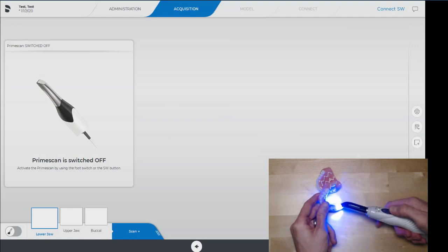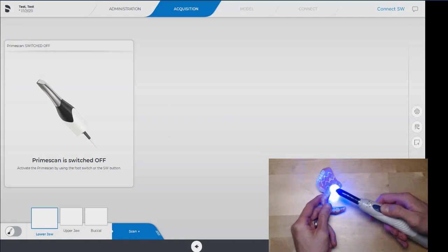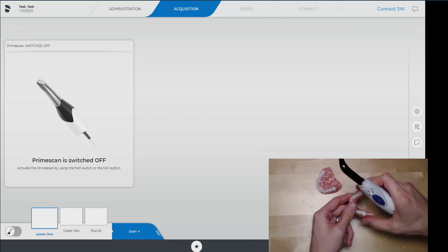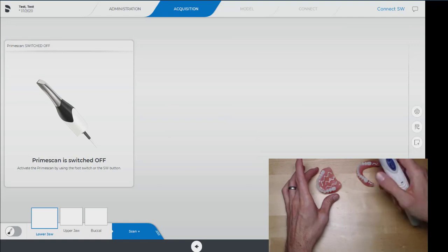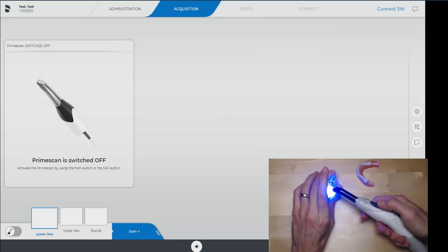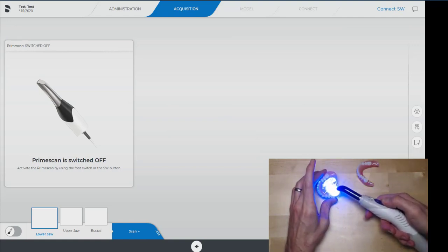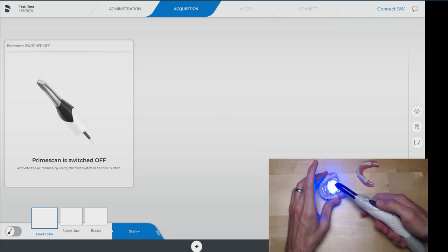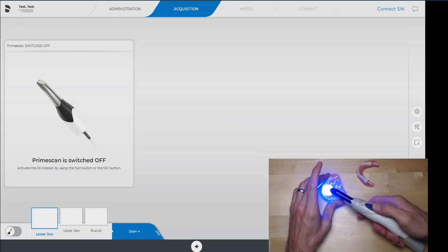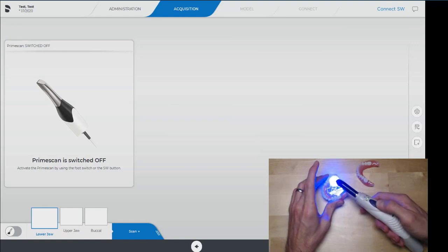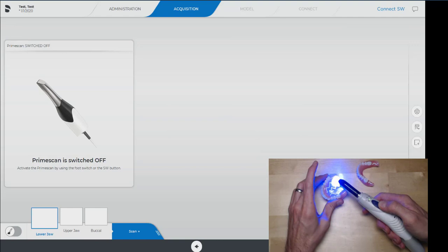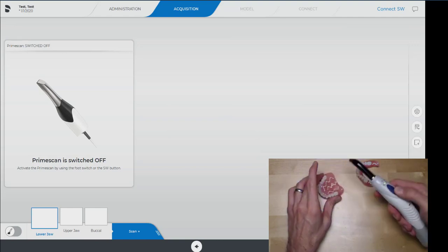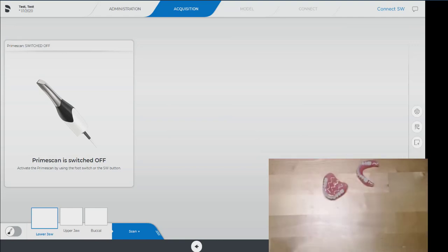And the liquid dam does tend to cling to the tissue very well in the mouth. If you're trying to scan someone's palate and you're in a smooth area and the CEREC can't really figure out where it is, we will use the liquid dam in those situations. A lot of times the palate will have enough anatomy that we're able to not use it. Okay, so we are going to go ahead and get started.